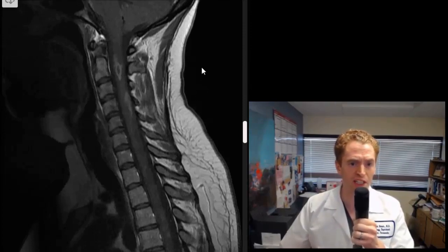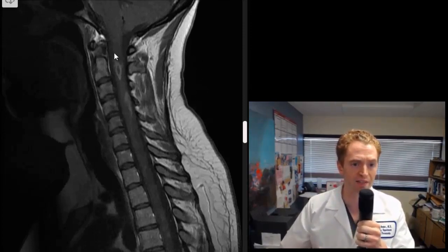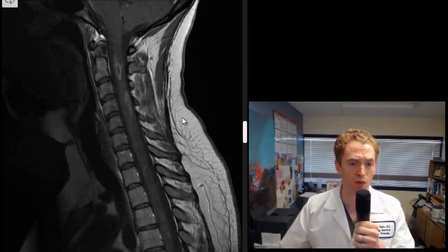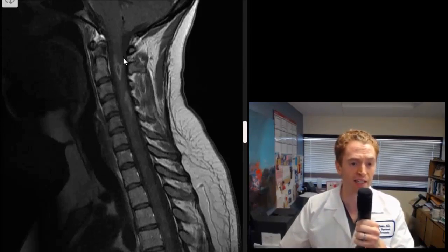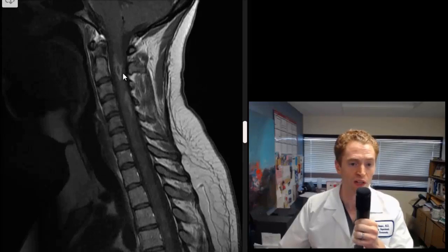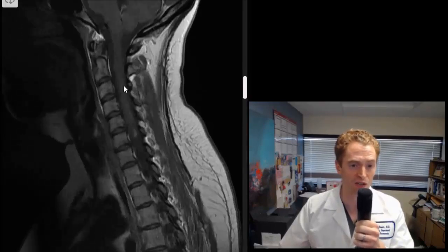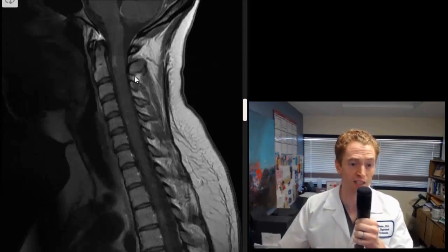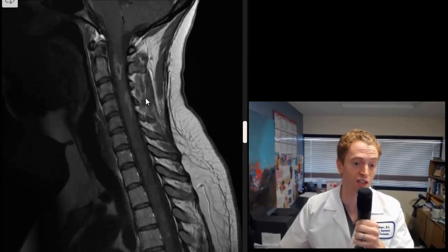Looking at the T1 images with contrast, many of the lesions take up the dye. With active inflammation in multiple sclerosis, there's a breakdown of the blood-brain barrier and the dye seeps into the lesions, making them look very bright. You can see the lesion on the left side of the C2 spinal cord looks very bright and is enhancing. There are also patchy lesions further down, and this smaller lesion on the left side also looks active. So this individual has multiple simultaneous enhancing lesions of the cervical spine.